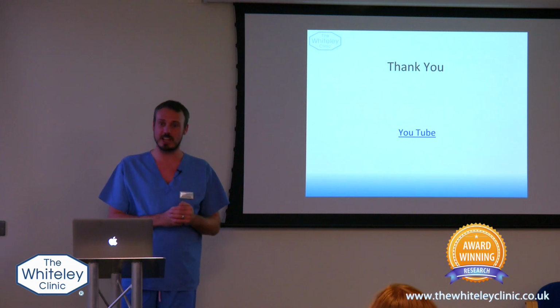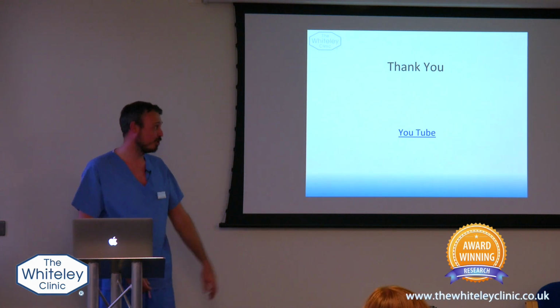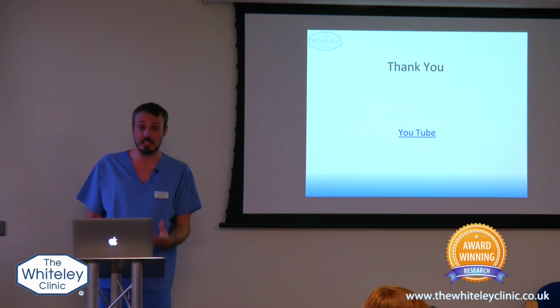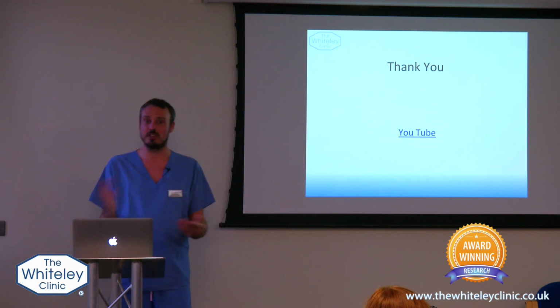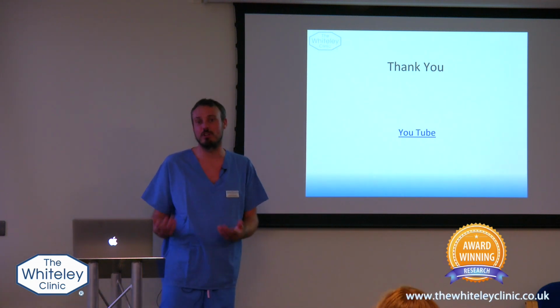In the first 100 cases, he'll have been doing exactly what we've all done, and that's refining our technique. So, for example, not putting the coil in that position. He'll have been putting coils deep down. He might have been looking at the vein saying, it's a 5mm vein, we'll put in a 5mm coil. Of course, then the patient stands up and the vein isn't 5mm anymore, is it? It's 10mm, so the coil can move.